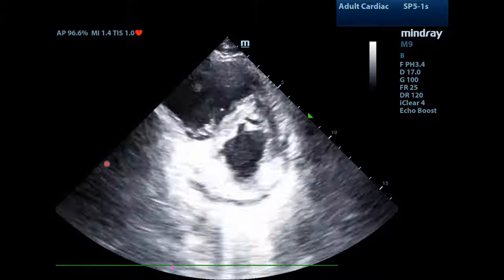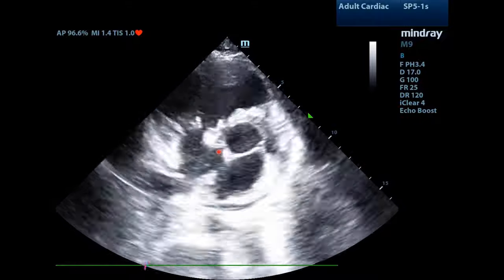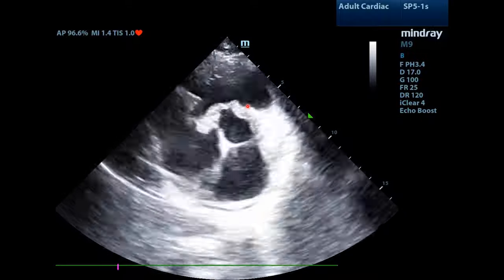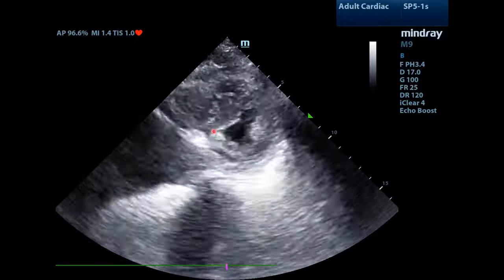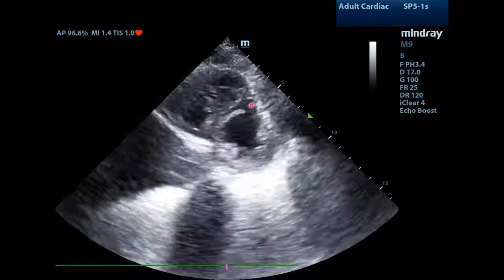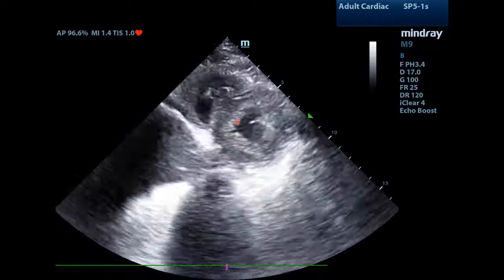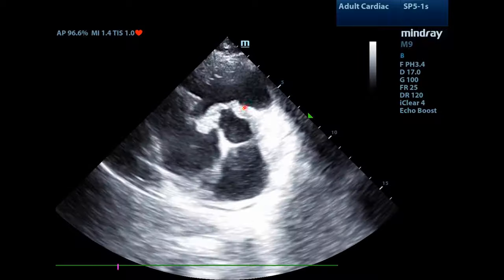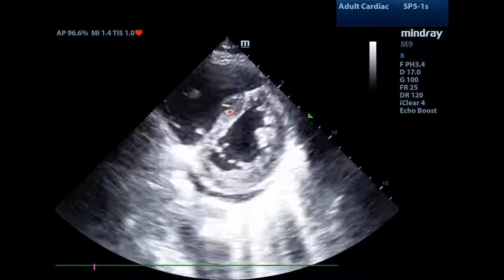We have now obtained a parasternal short axis view. Unfortunately the probe is moving a bit while the view is obtained. But you'll notice as we move from a basilar to an apical view that there is flattening of the interventricular septum. It is hard to tell which part of the cardiac cycle it is present, but this goes along with RV volume overload.